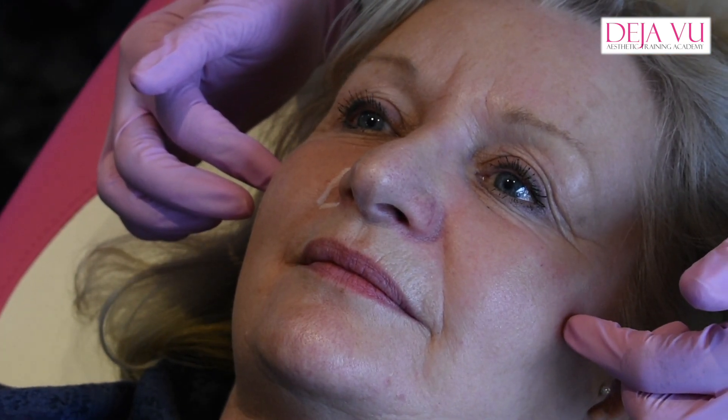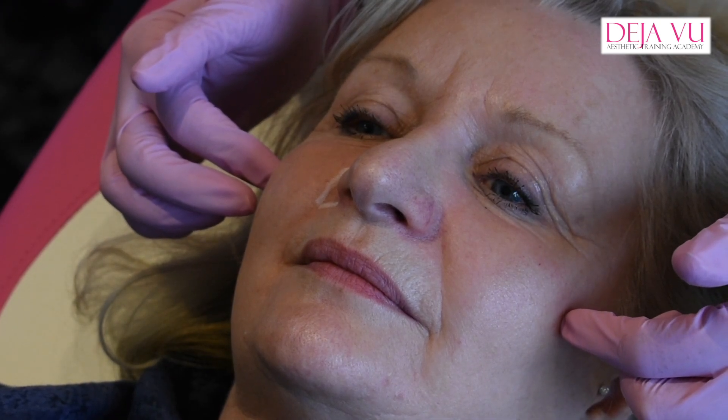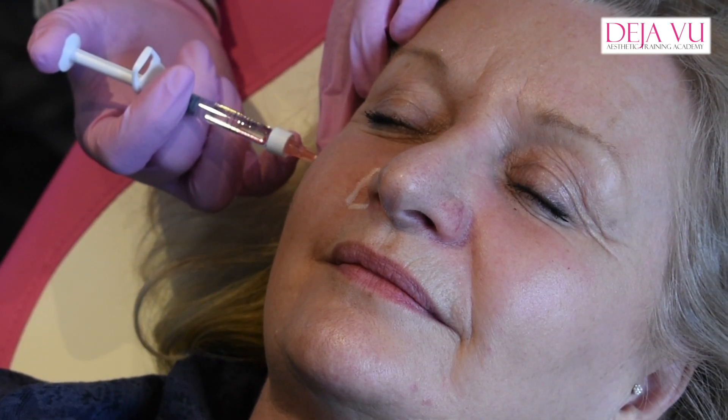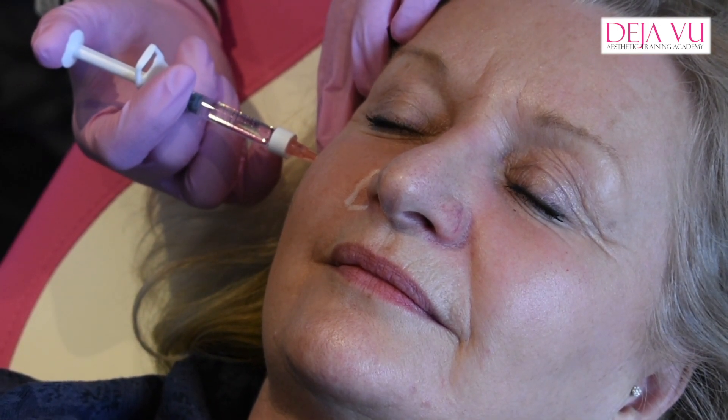If I was to aspirate there, you need to pull back a lot. The filler itself is very viscose, it's a thick gel, so you need to pull an awful lot back. Go in gently. Right, I'm on bone.